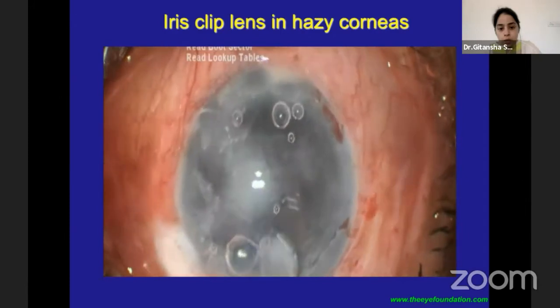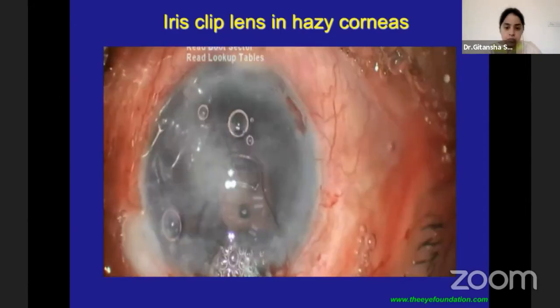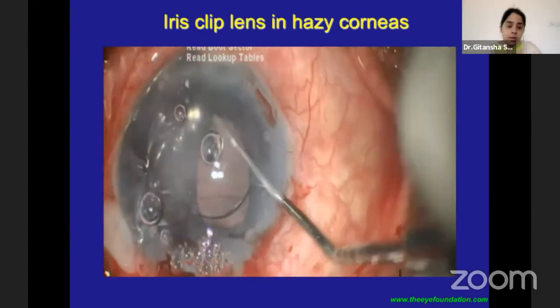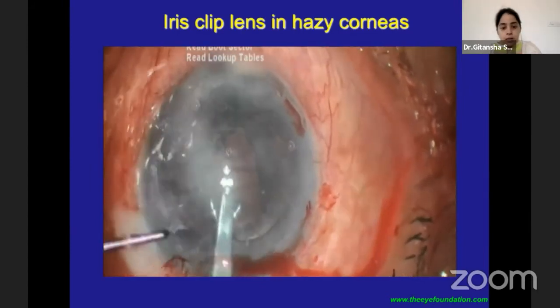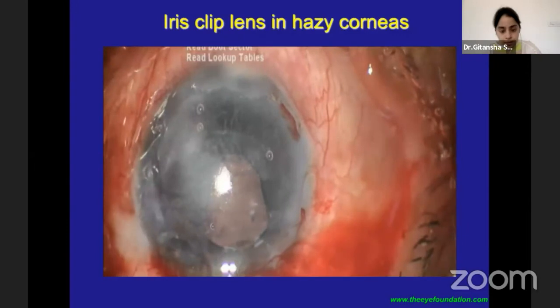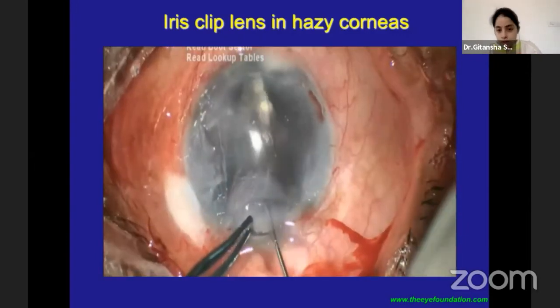So we're making a corneal incision here of around 6 millimeters, both for the insertion of the lens and subsequently for the DSEK corneal donor graft. The lens is again rotated around the horizontal position, and the optic is held by the IOL holding forceps, following which it is tucked under the iris and enclavated. Now, the enclavations are actually fairly strong.